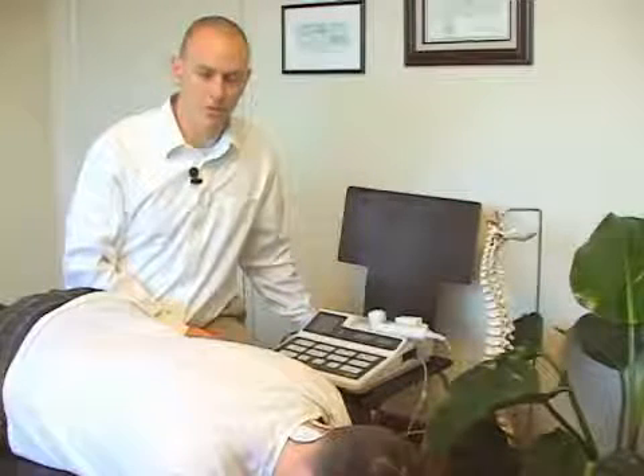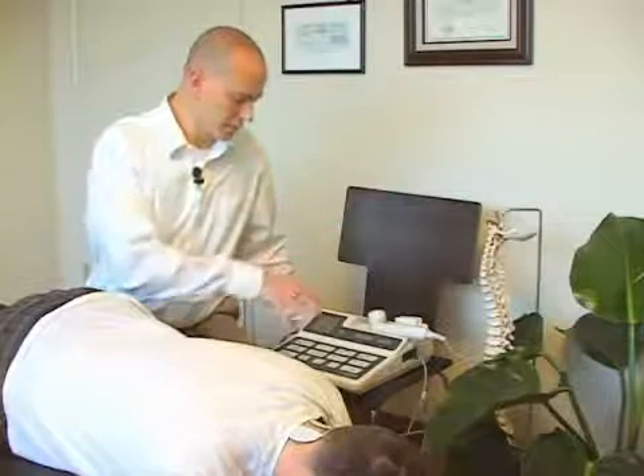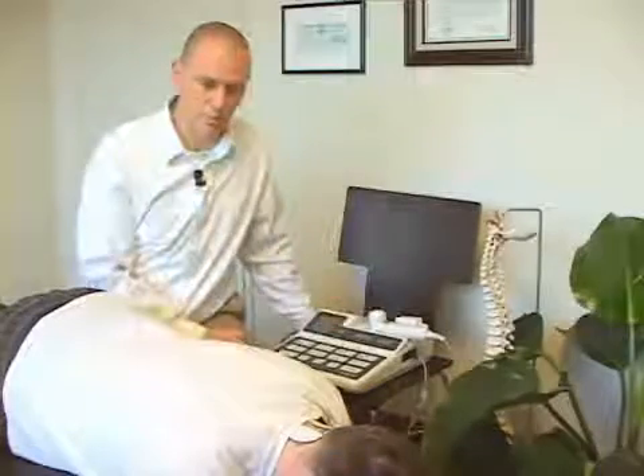After an adjustment in many chiropractic offices, adjunct therapies are done as well to complement the effects of an adjustment. There are many different types of adjunct therapies. Today we're demonstrating on this unit EMS, or electrical muscle stimulation. There's also an ultrasound head here as well that we could typically use.